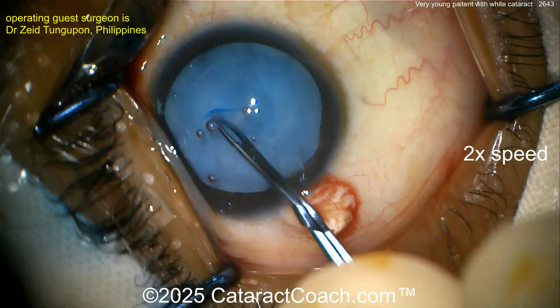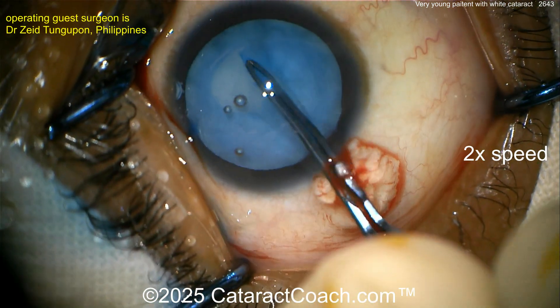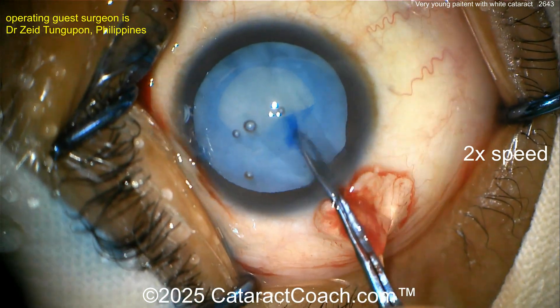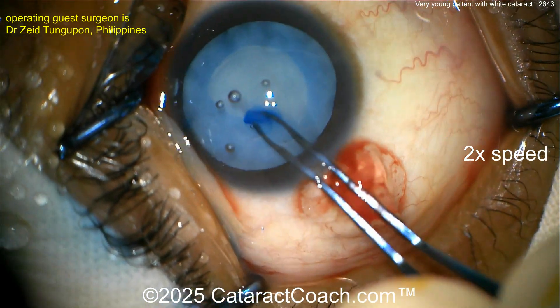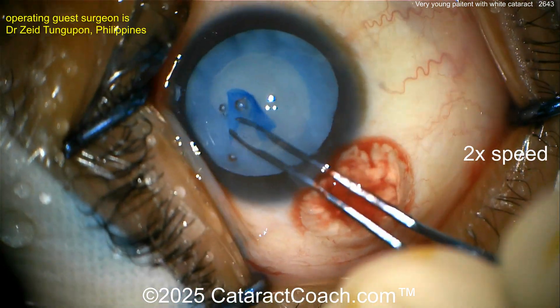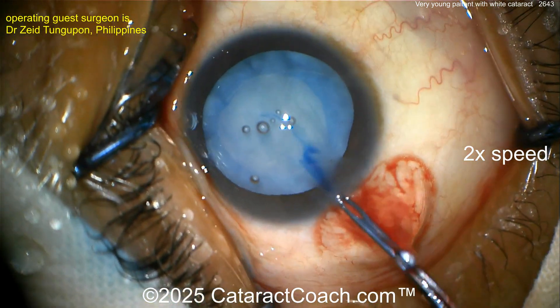Now here you could just do a baby rhexis and then fully decompress everything — put the I/A probe in that hole. Or if you think you've got enough control, you can just continue and get your normal rhexis done. But in these cases, because there is no nucleosclerosis, you put the I/A probe in the eye. In fact, you can just use BSS on a cannula and basically wash out all the lens material or most of it.